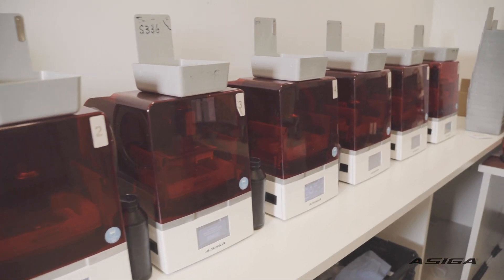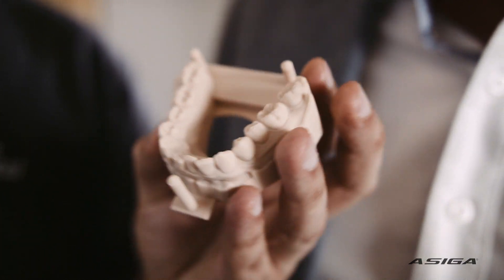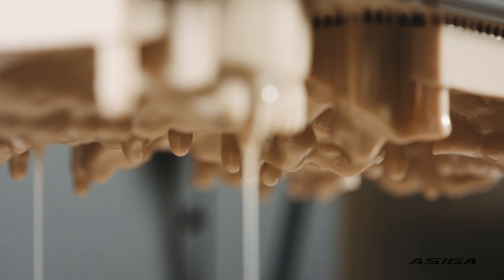We went through an enormous amount of research and development when we chose printers. We've had different types of printers over the years. We worked them pretty hard and we saw a lot of deterioration over time. When Essiga came along, we realised that we found an excellent product that didn't deteriorate. For us, it was a no-brainer to take on their Essiga product.